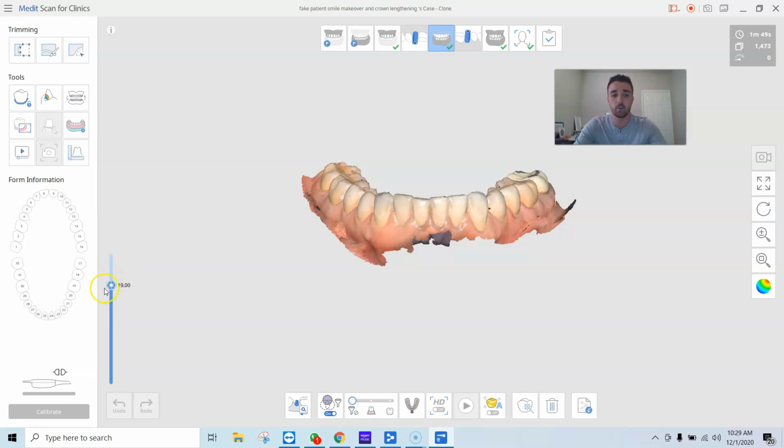Now, as we knock the focal length lower and lower and lower, now the advantage becomes when retraction is difficult, there's going to be less model cleanup, simply because the camera cannot see as far. So if I'm imaging in areas where retraction is difficult, if I'm ever imaging for an open bite and there's a tongue moving in the background and it's distracting the camera, be sure to knock down your focal length even as shallow as 12 millimeters, because the camera's going to ignore all the artifact and outside noise.